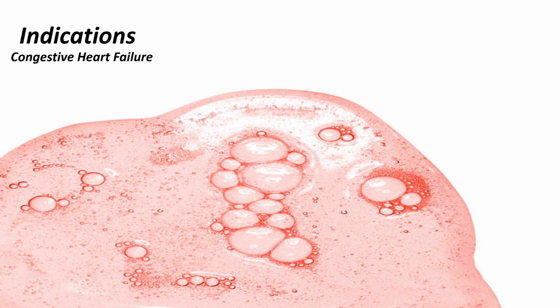Your patient is having an acute cardiac event that is causing ineffective blood distribution. They're going to present with a variety of symptoms depending on the area of the heart that's failing, but they can generally be spotted by their chest pain, dyspnea, edema, all those classic cardiac symptoms. Essentially, we're going to be using CPAP for these patients to treat either a dead space ventilation problem, which would be the mechanical failure of the heart to produce enough blood flow to distribute oxygenated blood, or we're going to be using CPAP to treat a shunt perfusion of pulmonary edema.